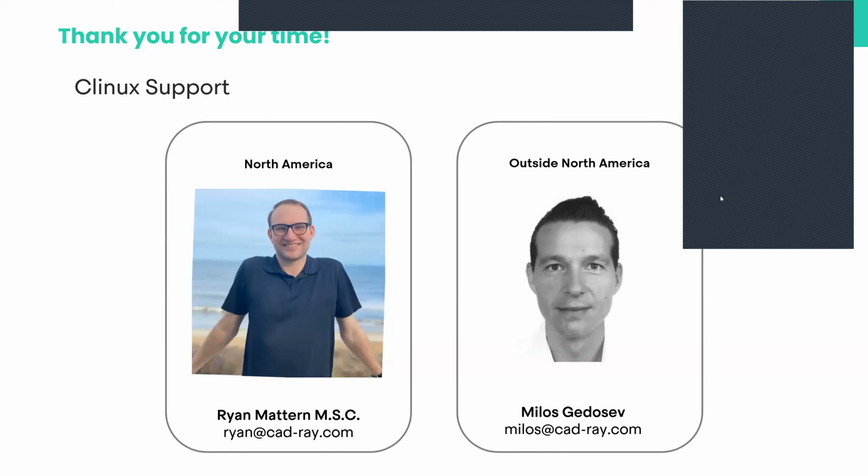Now we do have a clarification on that first question. The first question was, what's the best way to build up connectors? And the clarification from the doctor is connectors, crown, splint to the platform. Sorry, now I understand. Good. Doctor, I have to tell you this. I'm not a 3D printing expert, and so I would refer this question to the Clinux user group. I'm going to ask this question anonymously in our Clinux user group for you. Thank you for sharing that with us.